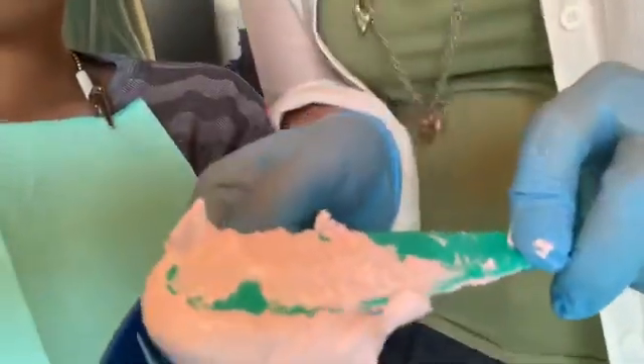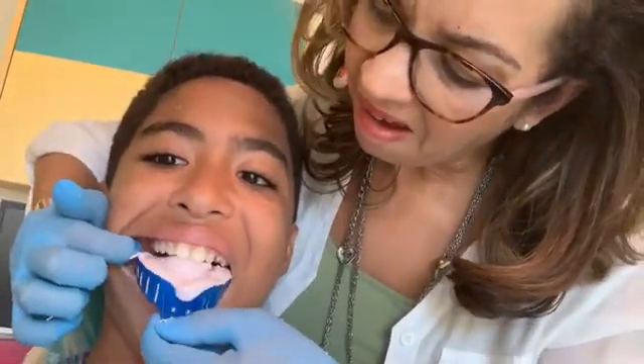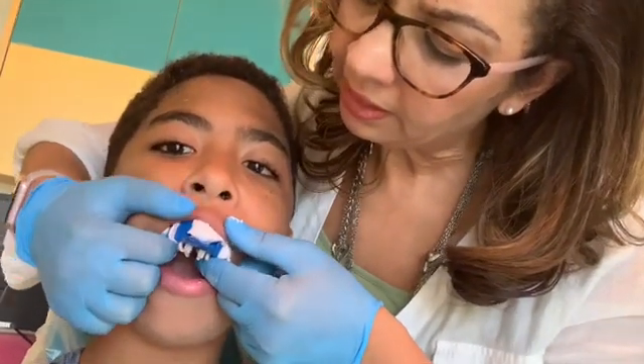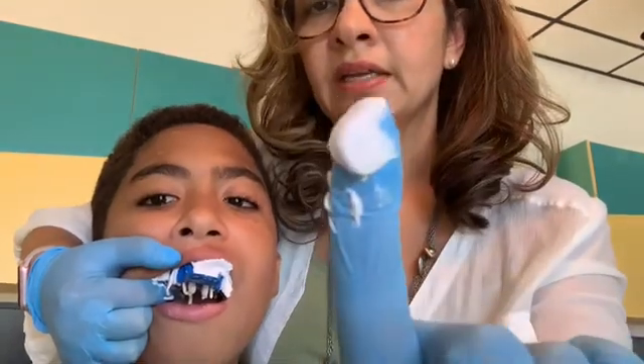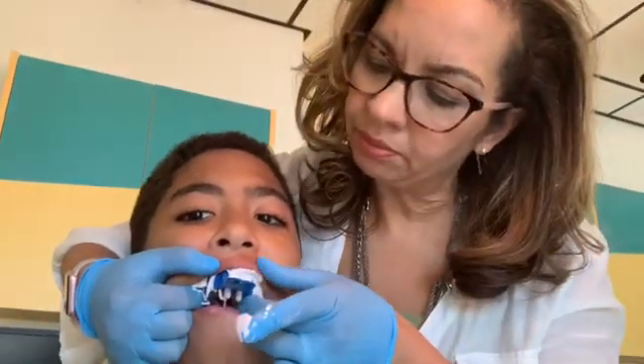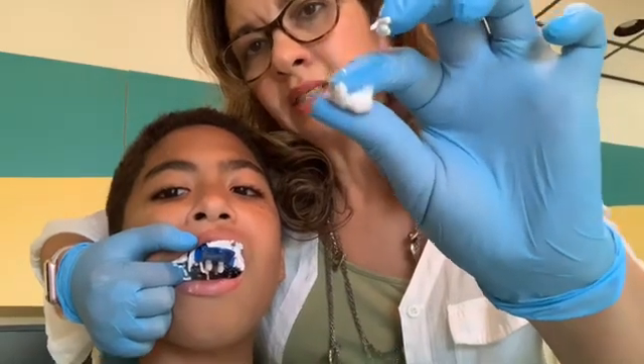We want to get it a nice smooth consistency, going quickly around and around. This is great for prospective dental students — nice and smooth. It's lilac, but we need to get it into the tray right now — load it in all the way around. It's starting to turn pink so we've got to keep going. A little bit on the top, and then Nicholas, get ready — say ah, go up on the back and push forward in the front. It only takes a few seconds to set up. Once it goes from pink to lighter white it will turn from mushy to rubbery, and once it gets rubbery we're ready to take it out.